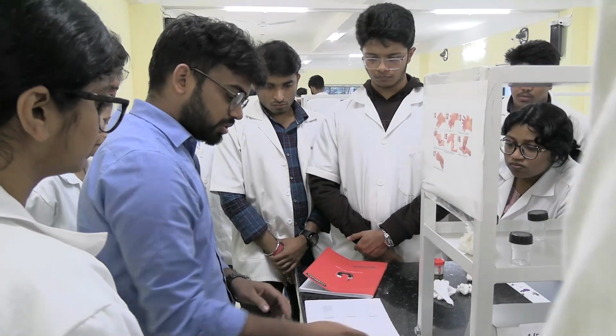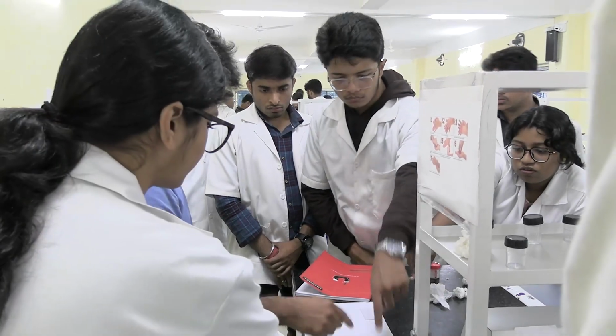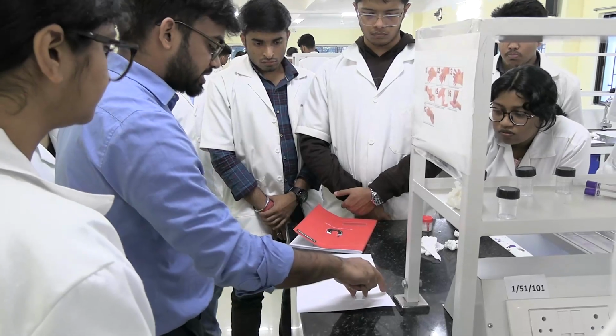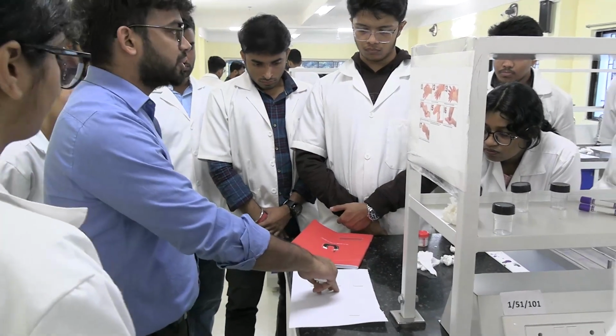Which edge was the spreader edge? This one, no? So I don't touch this part. This one is the spreader edge. These three slides are there. Now you know how to make a peripheral smear.